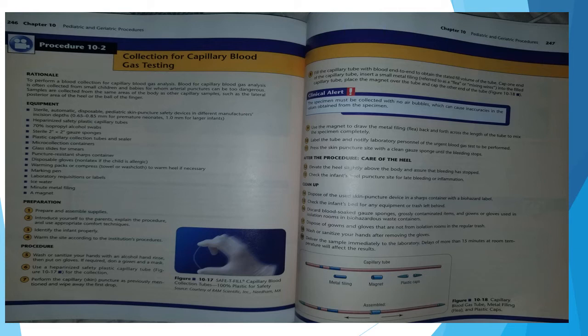Use a heparinized safety plastic capillary tube for collection. Perform the capillary skin puncture as previously mentioned and wipe away the first drop. Fill the capillary tube with blood end to end. Obtain the stated fill volume of the tube. Cap one end of the capillary tube. Insert a small metal filing, referred to as a flea or mixing wire, into the filled capillary tube. Place the magnet over the tube and cap the other end of the tube.